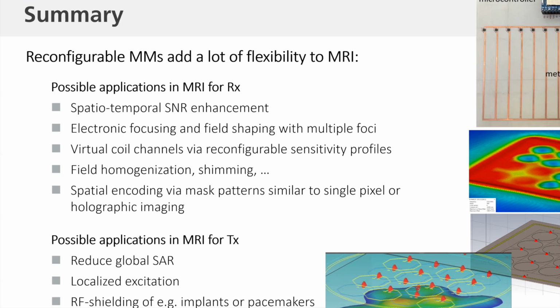But if you have a high spatial resolution of 1 millimeter, your typical penetration depth won't be much better. So you will be on the order of just 1 millimeter penetration depth, and then you're getting a surface image.